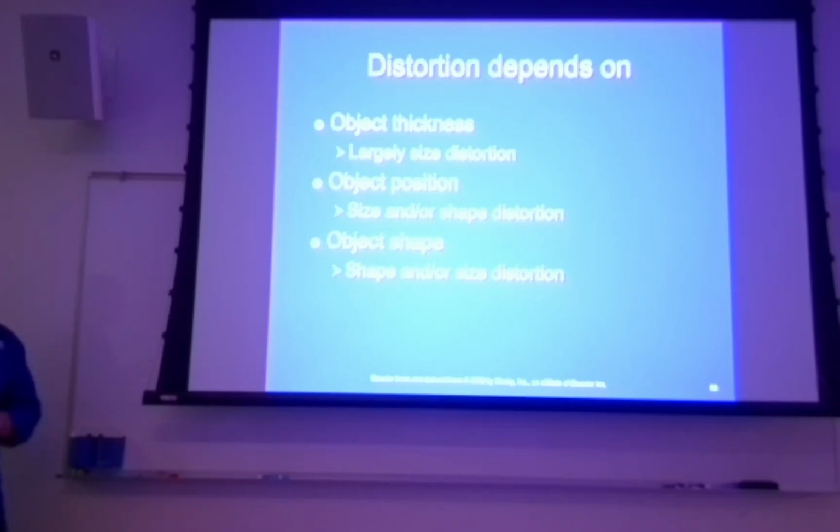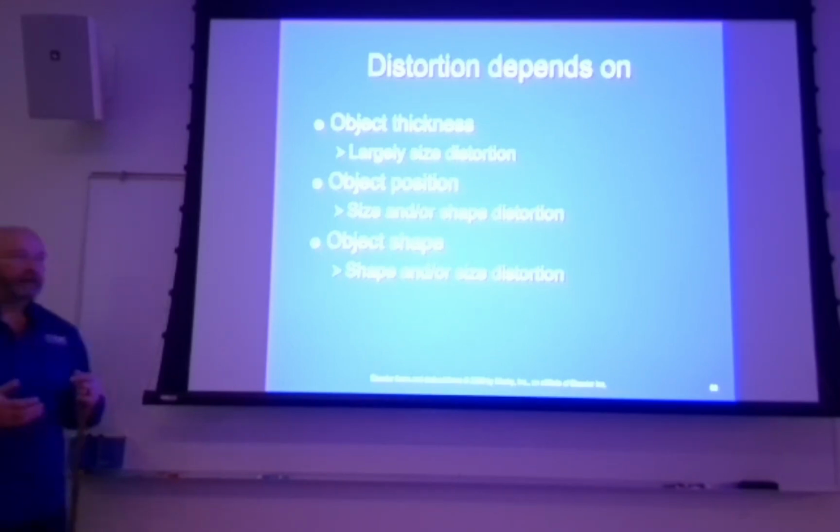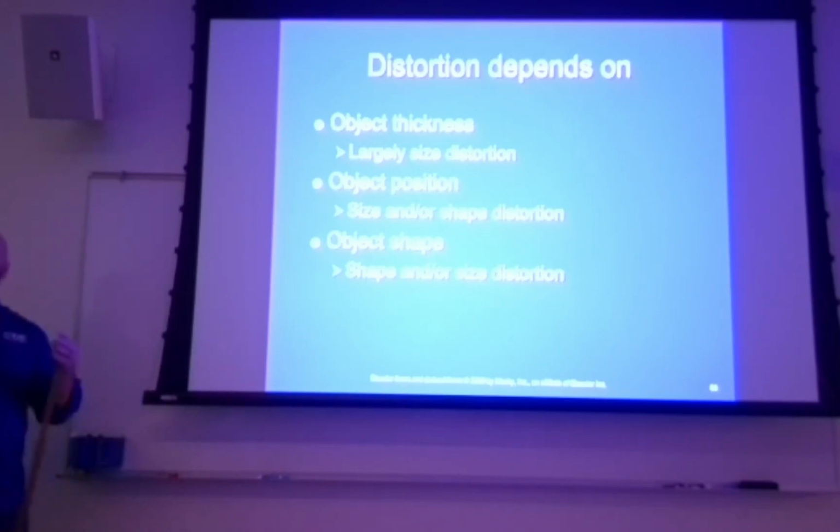You remember what we talked about first semester and second semester imaging about the wrist bones is that they're conical in shape, right? So with them being conical in shape, they more closely follow the divergence of the central ray if you shoot them AP as opposed to PA.